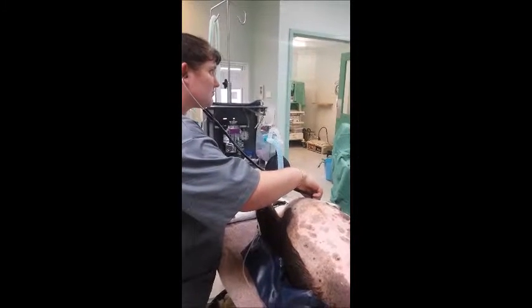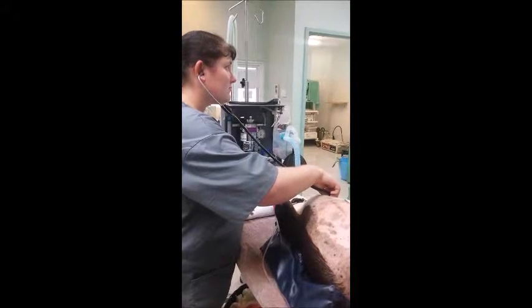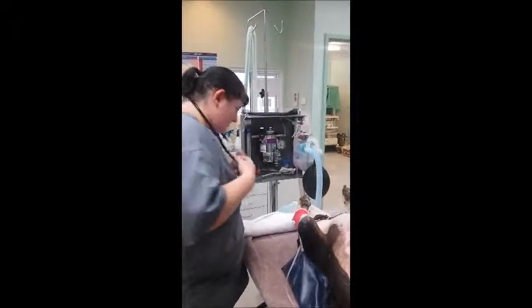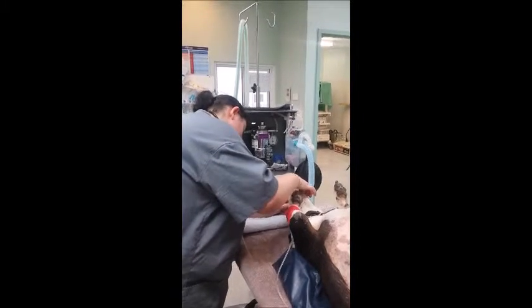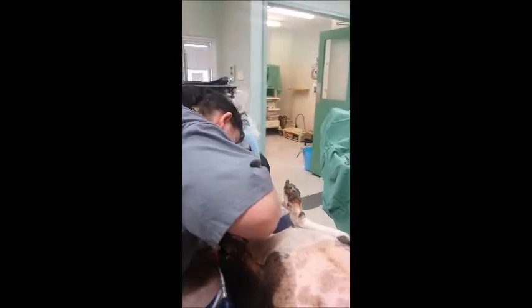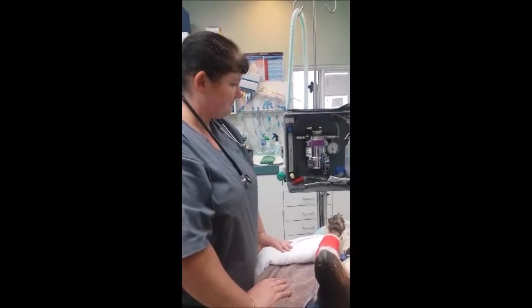Once the patient is repositioned for hair removal, I check the patient's anaesthetic depth. I begin by checking the heart rate — the rhythm should be regular and consistent. I then check the patient's jaw tone, which should be relaxed. I then check the eye position. I check the paw withdrawal reflex and then I monitor the respiratory rate.